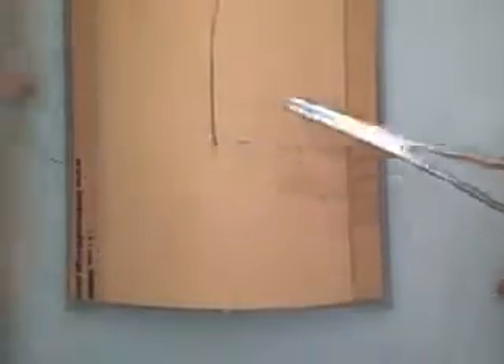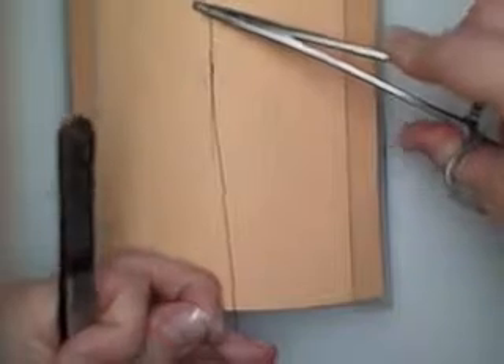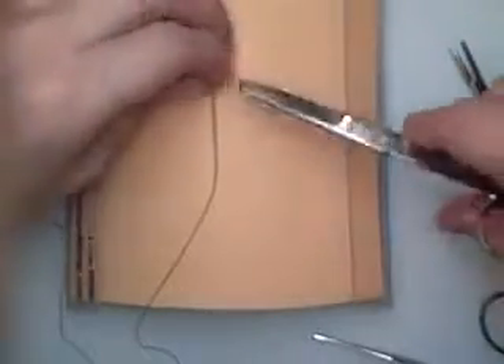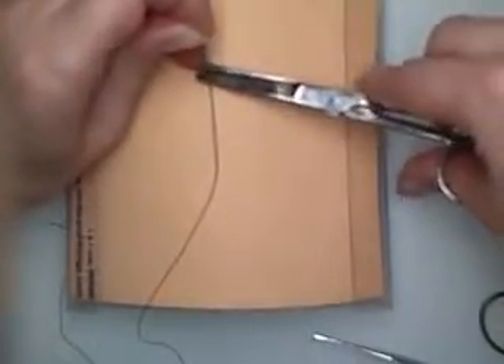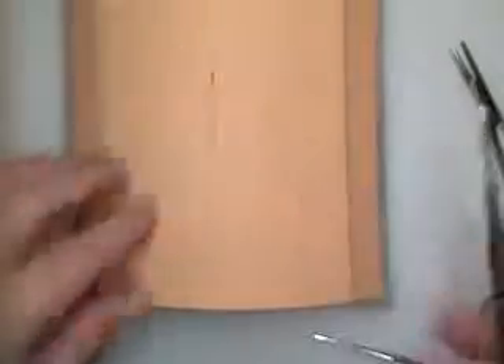You should not be able to see this knot. If you can see the knot, it might form what you call a spitting suture — that's when your patient returns with an inflamed, erythematous, maybe even purulent little infection, and you actually have to cut the knot out. This is called deep dermal stitching because it's below the top dermal layer.